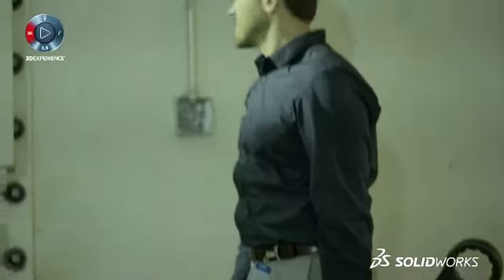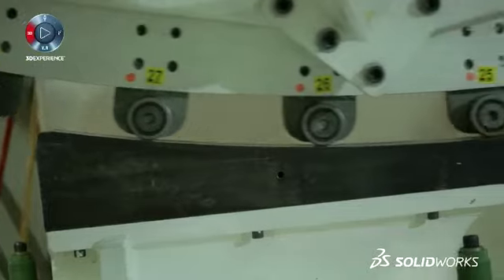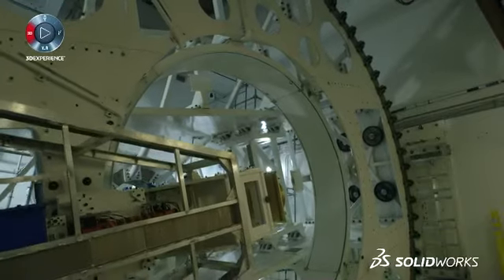We're building a cancer treating device which involves a lot of high energy physics. We need to put radiation into a tumor because that radiation will then kill that tumor. The cyclotron is really the drivetrain of a proton therapy system. It is the large particle accelerator that accelerates a proton to about 2/3 the speed of light.